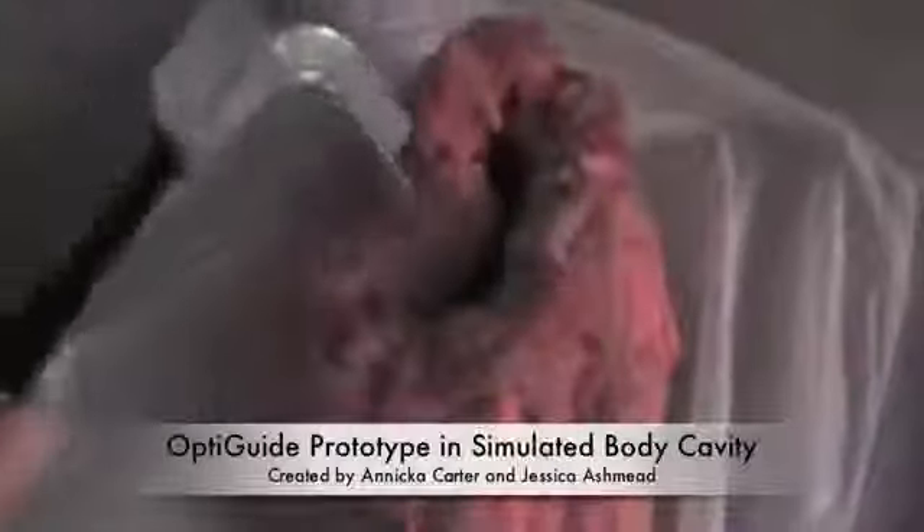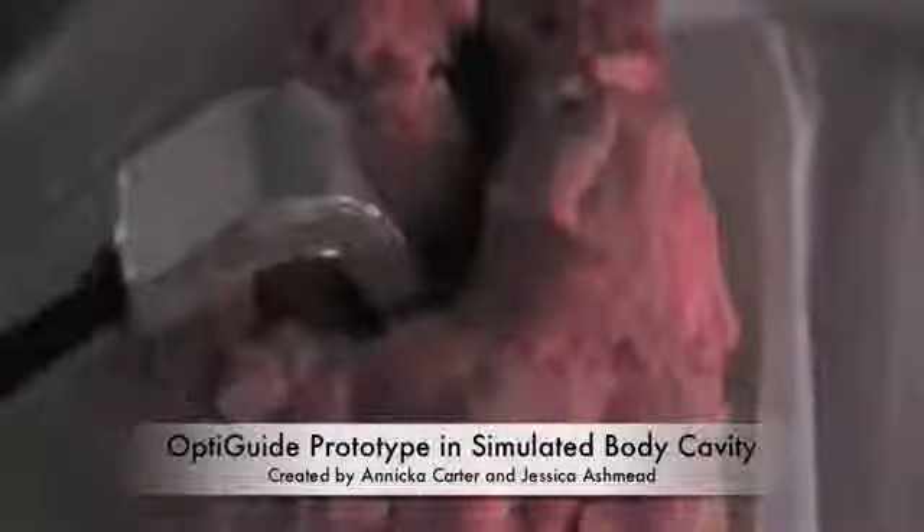The OptiGuide is designed to maintain a uniform light intensity, use a small and inexpensive battery source, while still lasting the duration of an average surgery. An elementary prototype has been created that lights the simulated body cavity.